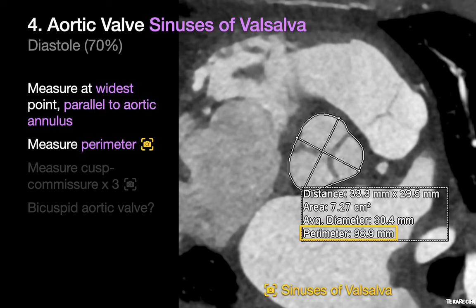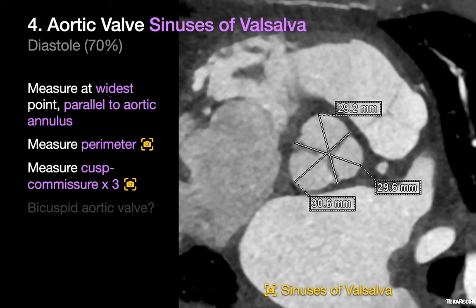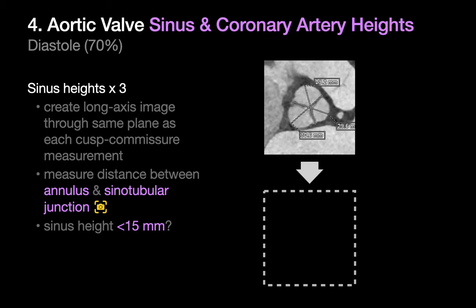Sinuses of Valsalva that measure under 28 millimeters are associated with a higher risk of coronary artery occlusion after TAVR. You'll measure the sinuses of Valsalva at their widest point and parallel to the aortic annular plane — measure and report the perimeter and do an image capture. Then measure and report three cusp-to-commissure distances and do another image capture. This will also be your best opportunity to recognize and report if the aortic valve is bicuspid. Bicuspid aortic valves are associated with poorer outcomes post-TAVR and carry a higher likelihood of paravalvular leak because their annuluses may be unusually shaped.